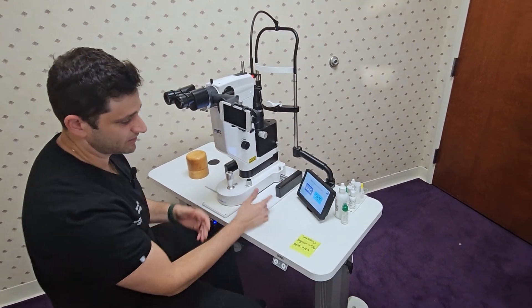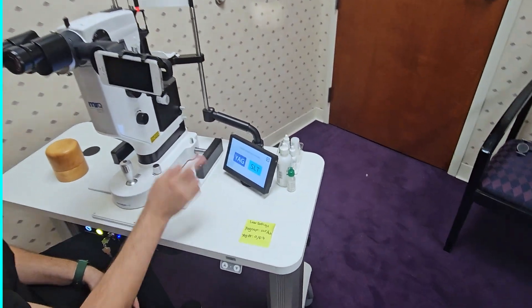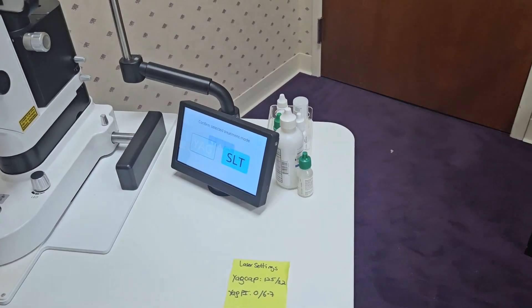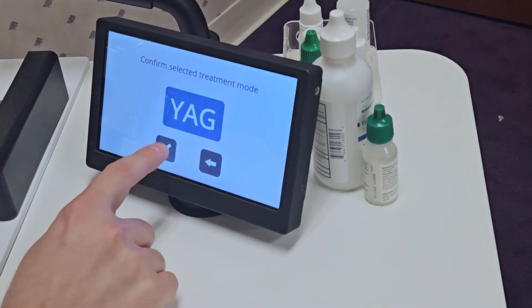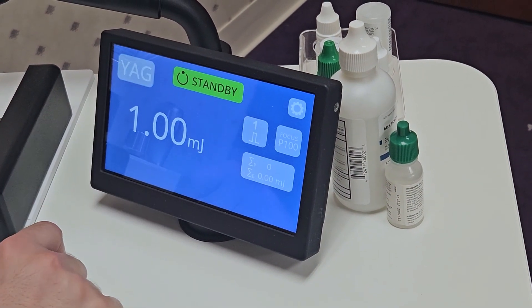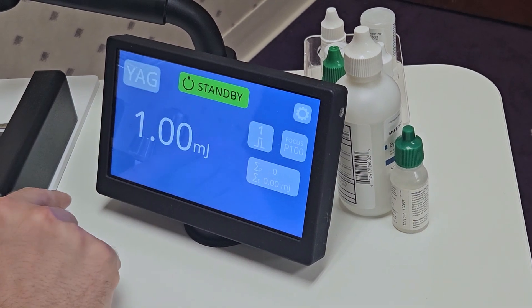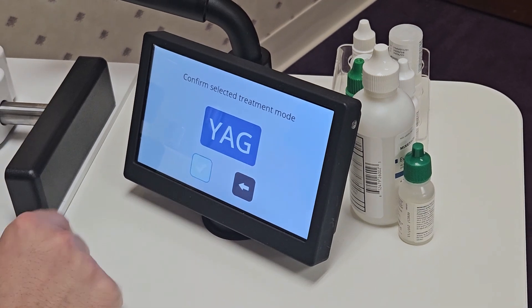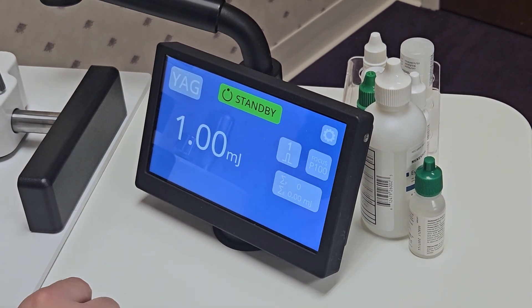Using the laser settings is navigated with these two main menu options. So first, if you go to YAG, you simply press there and then press check to confirm. If you were in the wrong setting, you just press that again and you'll go back to your main menu. So let's say we go back into YAG — confirming — this is your main setup.